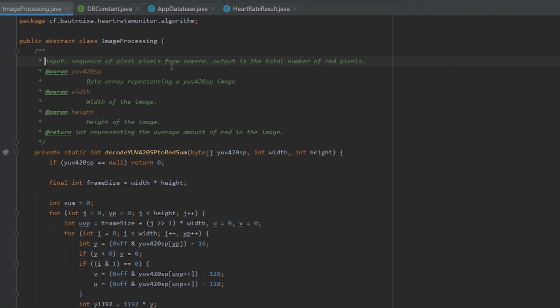First I'll be telling you how we are processing the image. We're using a preview callback function in Android Studio. That function gives us a different kind of image format. For video formats we have MP4, AVI, and different types of formats. Over here we have YUV 420 SP, a very different kind of format, where Y means luminance and UV means the color axes. So you have to convert it to RGB format.